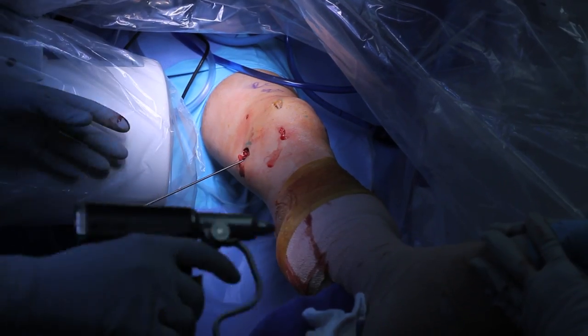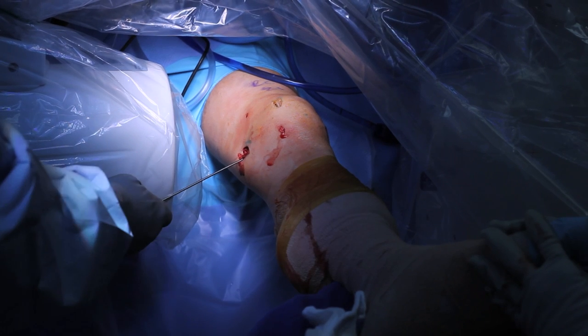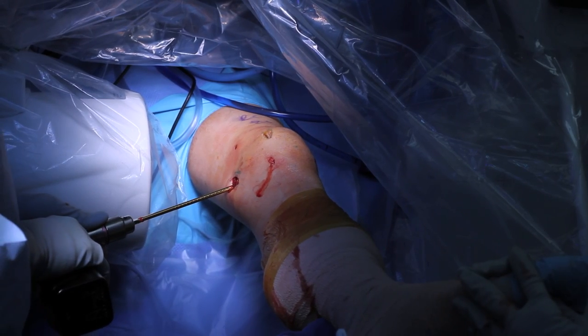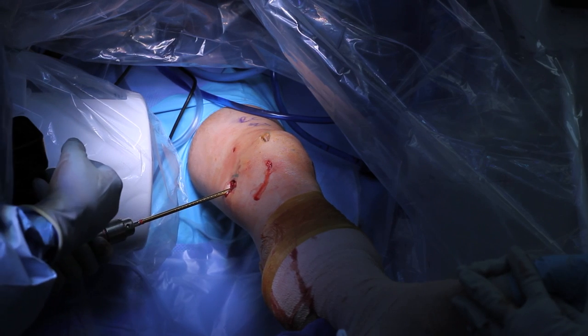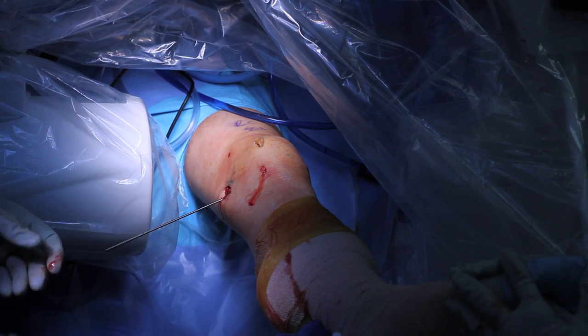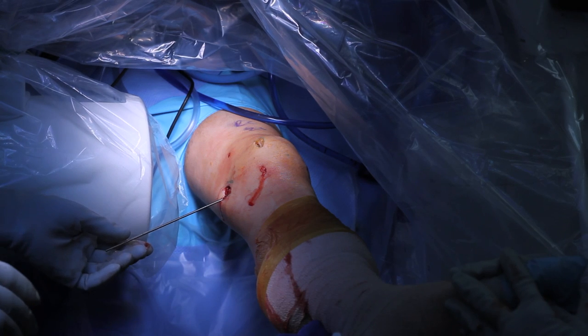A pin is advanced into the femur in exactly the place where the MPFL originates. The pin is then overdrilled with a small drill. This creates a socket in the bone. The tendon graft will later be seated in this bone socket.